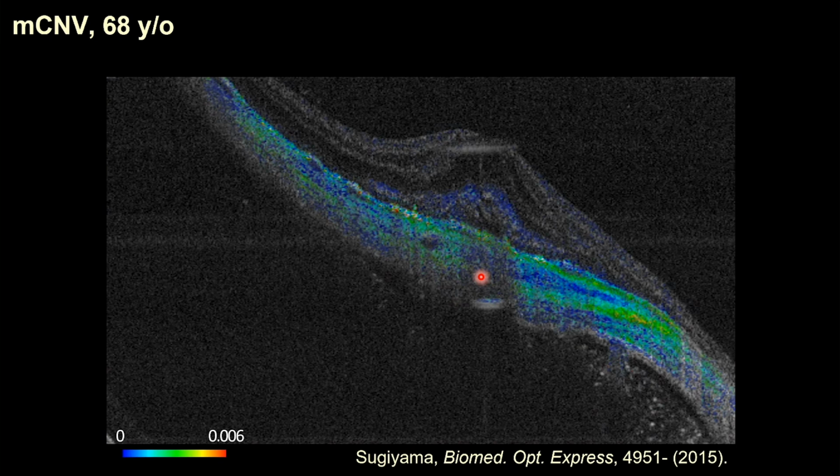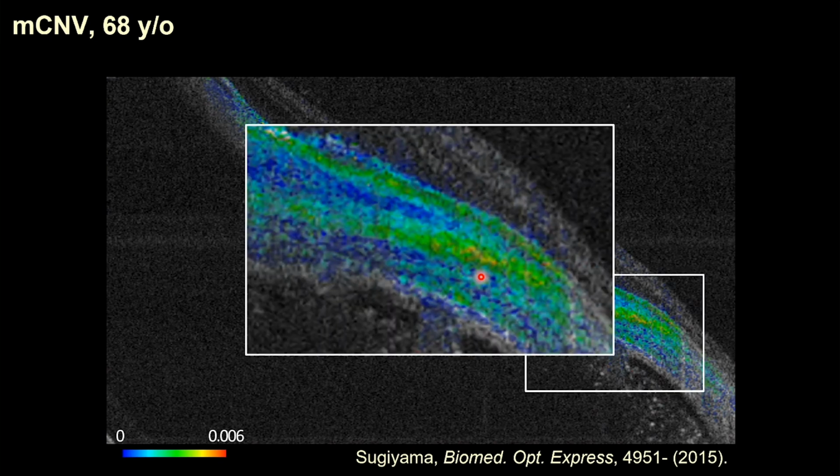By zooming in on this layer, we very clearly see the four layers here, and also here we see a very strong birefringence, red. We believe it might be the extension of the dura mater from the optic nerve head to the sclera. Dura mater is a kind of capsule of the brain, and it's connected to the eye, and it is actually a very dense collagen.